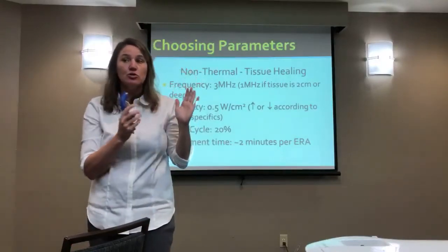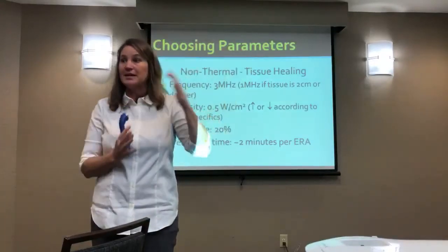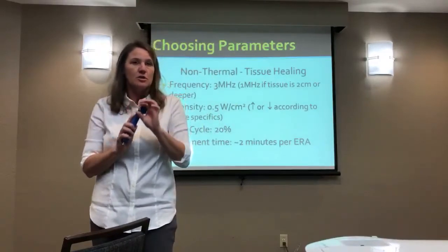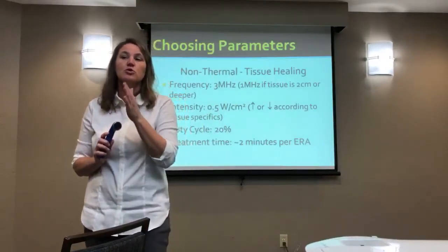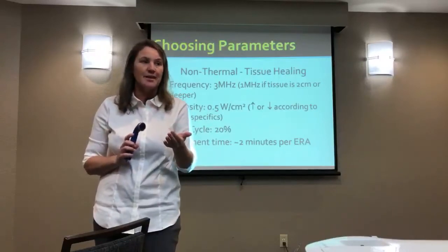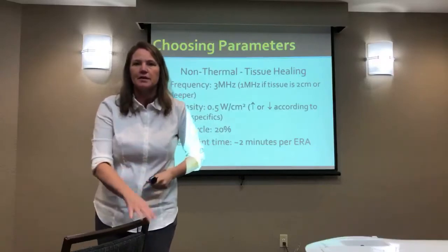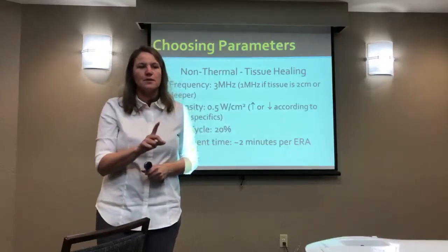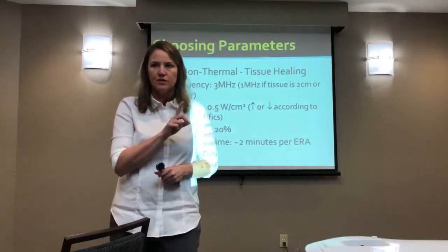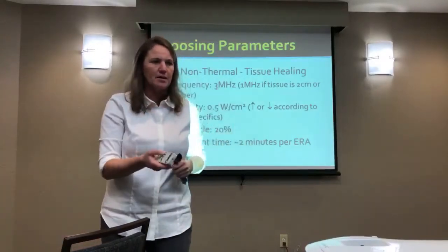Now you could treat a very large area, but it's going to take you 2 minutes for every space that size, so it's going to take you longer. It's not that you couldn't do it. It would just take a significant period of time, and I question whether I really need to do that or not. But from a thermal perspective, which is what we're going to move to, should we move to it now? Are you ready? Do you feel like we're good with this for now? Because when we do the case studies, we'll end up coming back to this again.